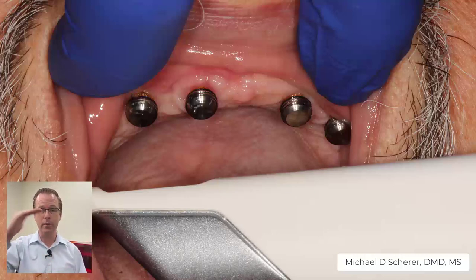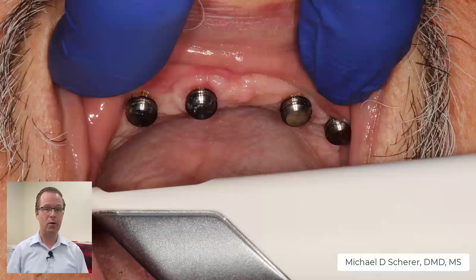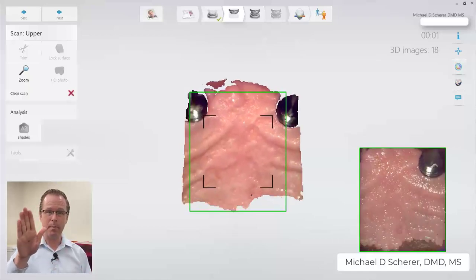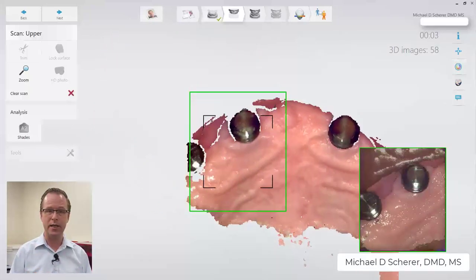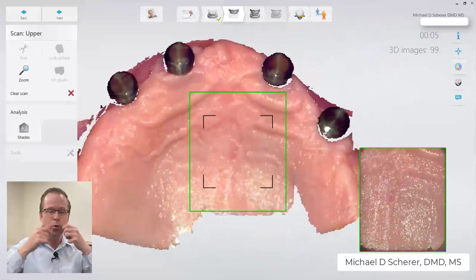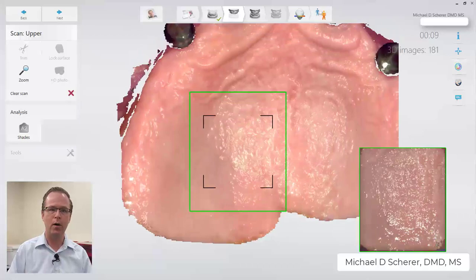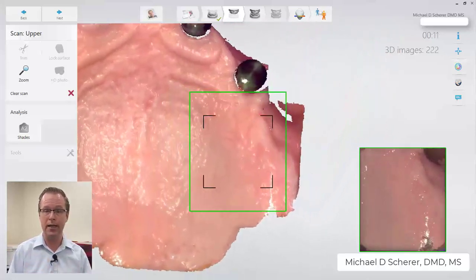I've placed my locator abutment housings, and now we're ready to start scanning utilizing my intraoral scanner. Once I have my intraoral scanner set up, I've selected the 3Shape TRIOS intraoral edentulous scanning mode, which turns on AI scan mode. I'll begin at the pre-maxilla area of the edentulous ridge. My assistant and I are holding the cheeks fairly taut, then we do a bobbin weave as we go across into the most distal or posterior aspect of the arch.